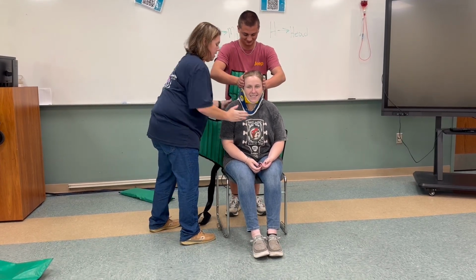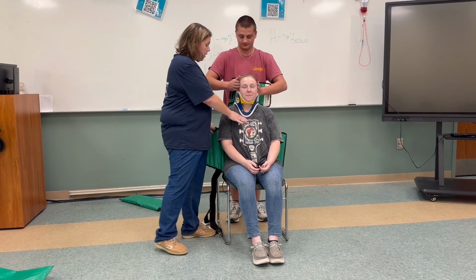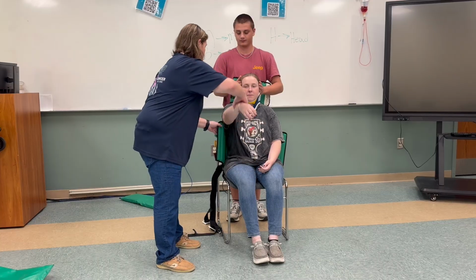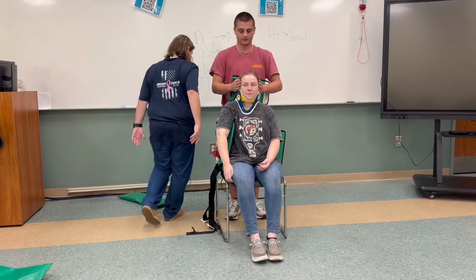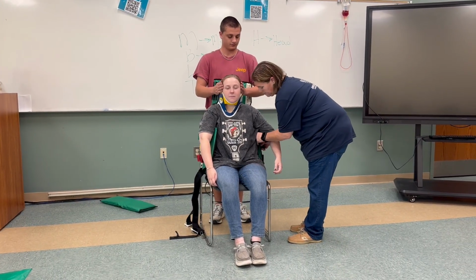All right, now on the count of 3, we'll go back. Ready? 1, 2, 3. And back. Now we have this where we can place the KED appropriately. So if you remember your mnemonic, I'm going to go upright just like that. And I'm going to come over here and get prepared. Up just like that.